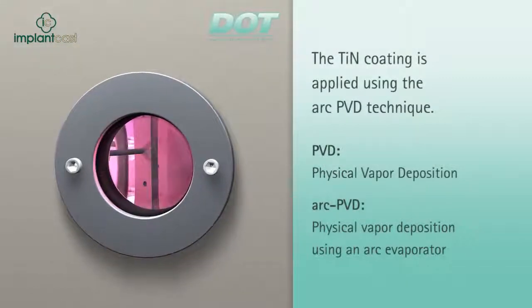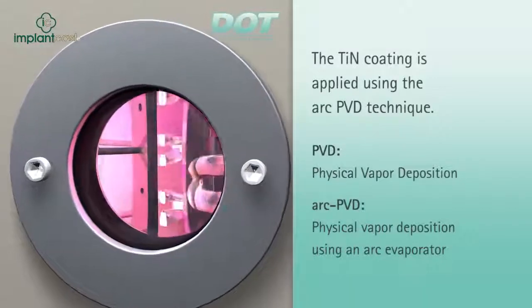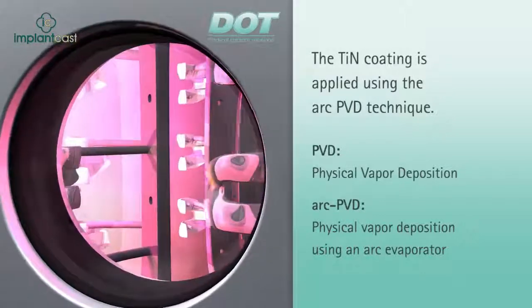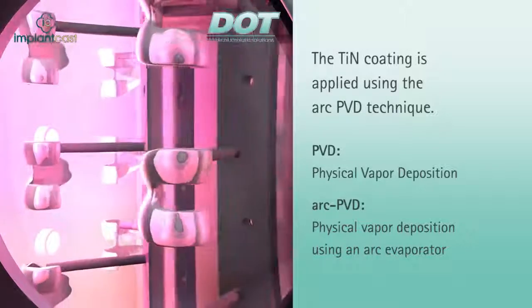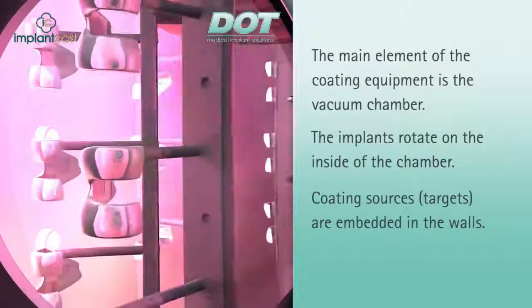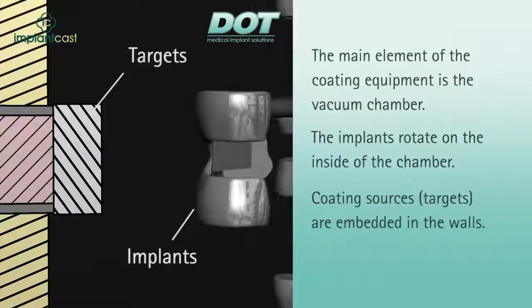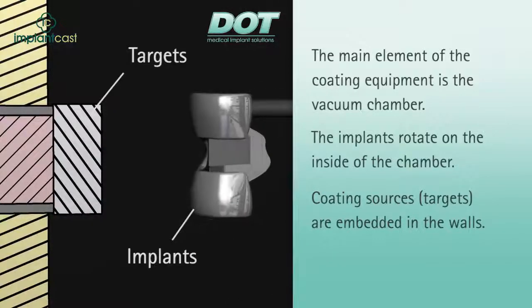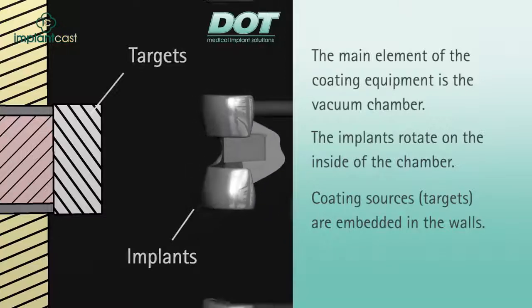Using the arc-PVD technique, titanium nitride layers are applied to titanium and cobalt-chromium alloys. This technique is distinguished by a very high ion density, excellent efficiency, and outstanding process security. In the PVD coating equipment, the implants are fixed on a turntable inside of the vacuum chamber. The coating sources, or targets, are installed in the walls of the unit. For titanium nitride coating, the target is made of a titanium alloy.